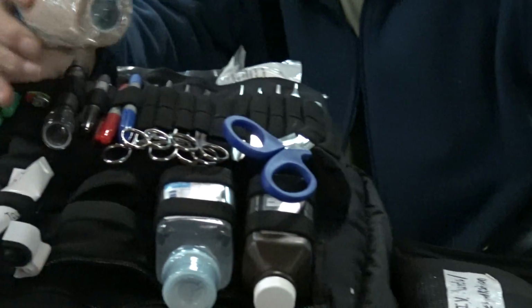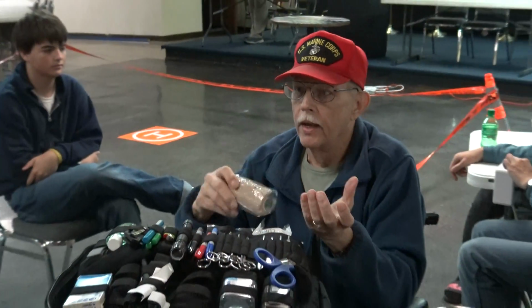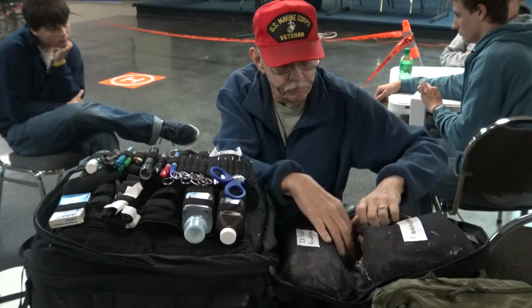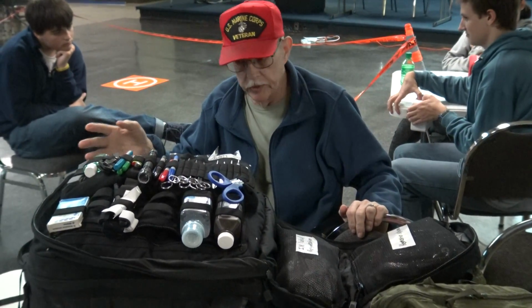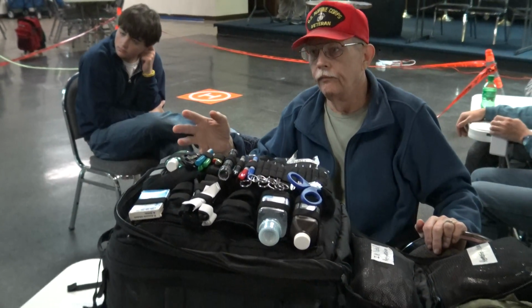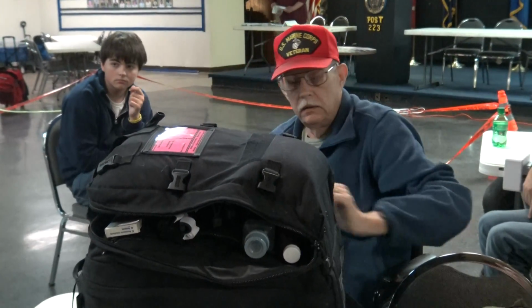So that you can take the SAM splint and you form your splint, you put it on there, and then you use these to wrap around it to hold it in place. Pretty nice thing. And in each of these pockets, I always like to keep about 3 pair of surgical gloves. Good luck finding those now.